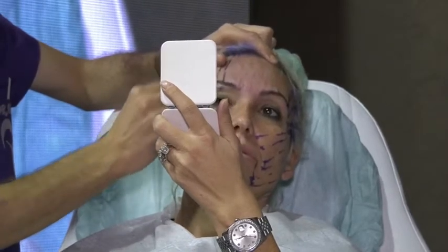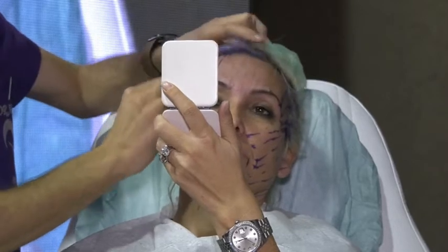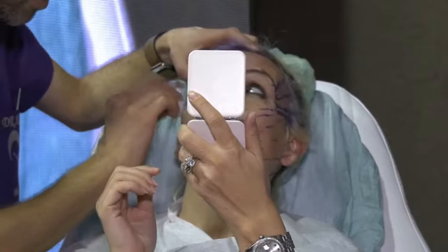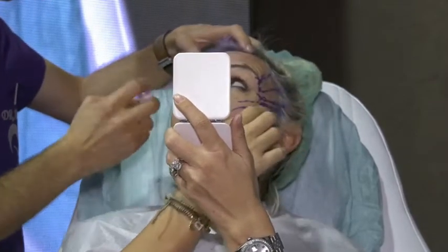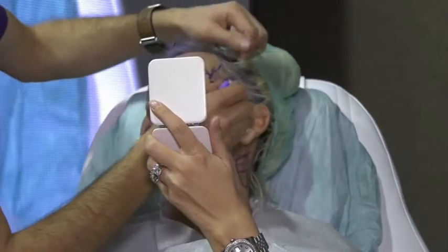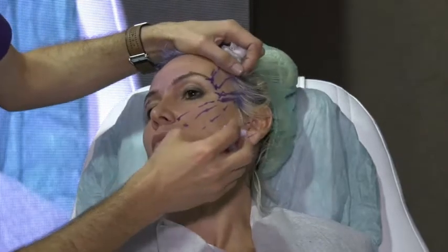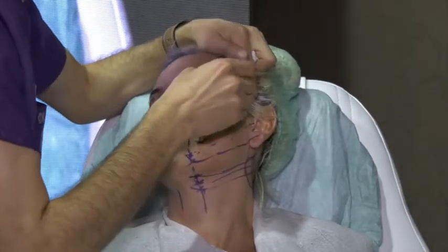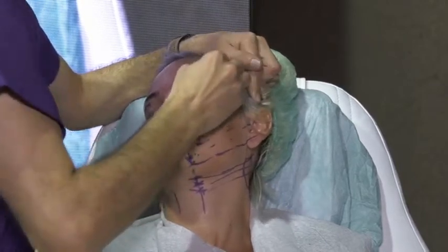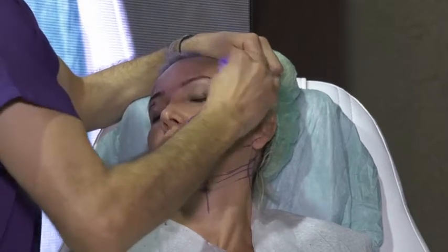You mean which is first? Okay. If the thread can move with this kind of movement, it will not stay more than 2 weeks. The thread is fixed. I don't pull. That's a very important point, guys. I never pull the thread. I never do manual traction of the thread. Never do that, because what you do manually will fall down again easily. Try to insert the thread in the best position and leave it.